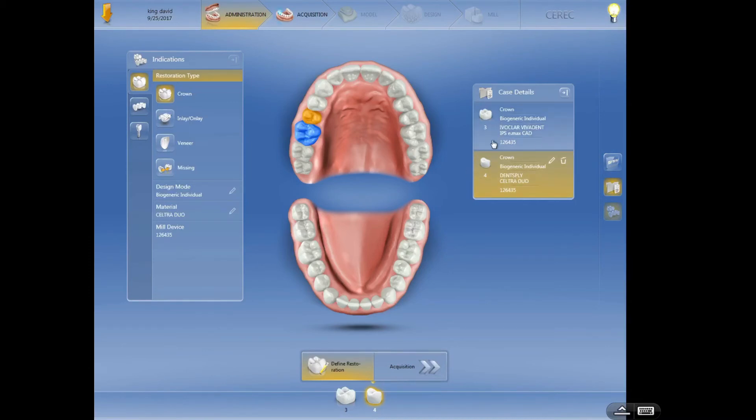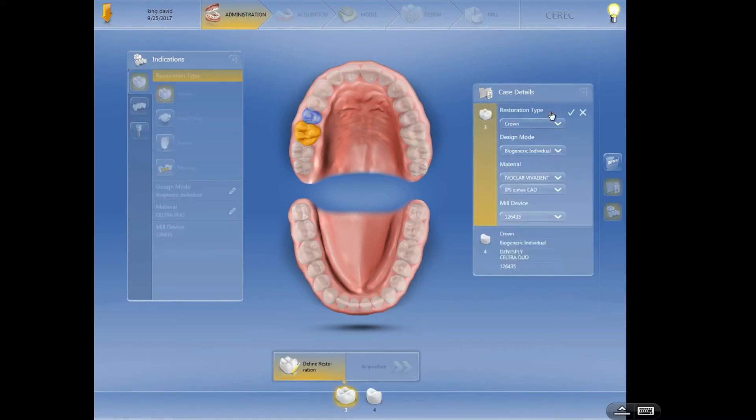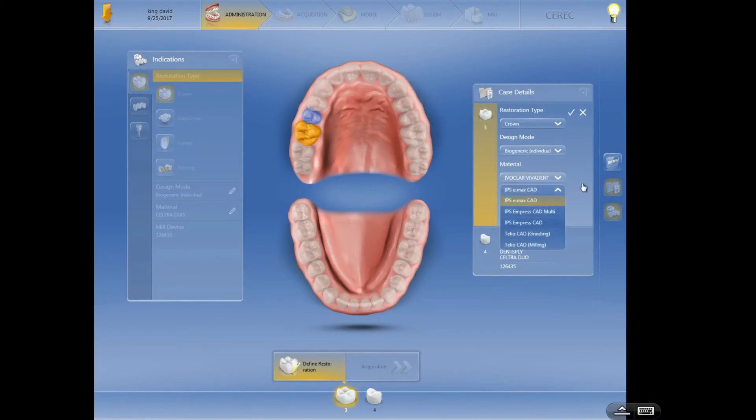Now what if I realize, oh I messed up, this one should be Celtra Duo also. So I can click on that tooth, then I need to click on this edit, this little pencil right here. Click on this edit and then I can go in here and change any of the settings.